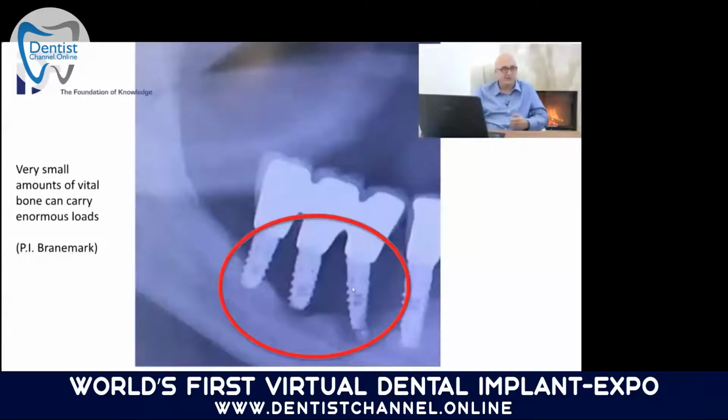And what is the most interesting story? It's not mobile. It's stable. The patient is chewing on it every day. Although all this bone is lost, the big surface is not required in order to create a load transmission. So this implant is integrated, a little bit of the apex is also integrated, and it does the job for this implant and for the two other ones also.